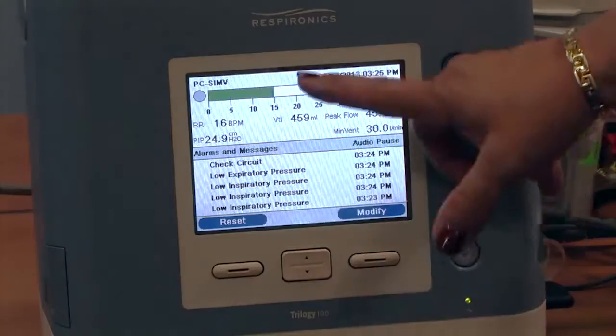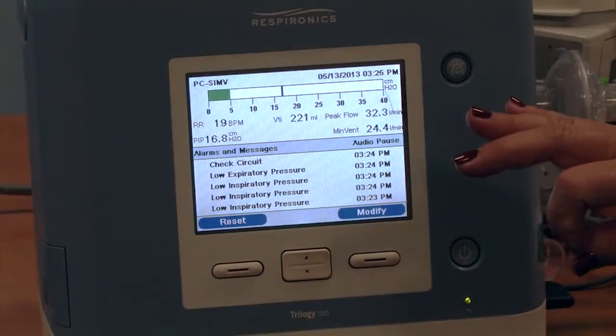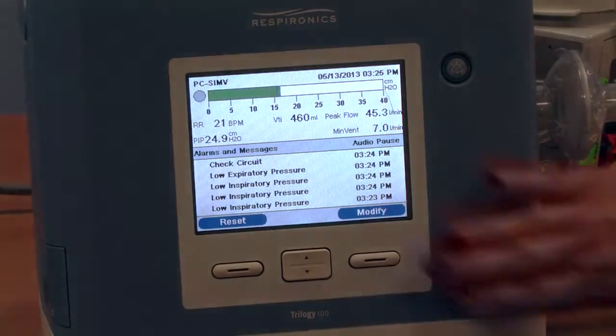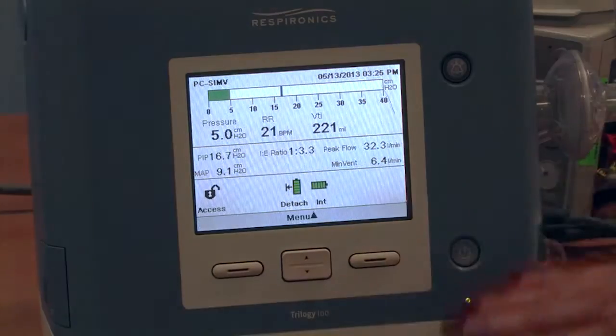So you see here we've got our menu. That can be erased, not if you're on limited menu view, but when your practitioners come out to your house, they can clear this alarm history for you. I'm going to just go to reset and go back to the main screen.